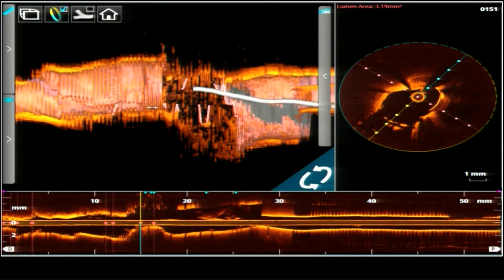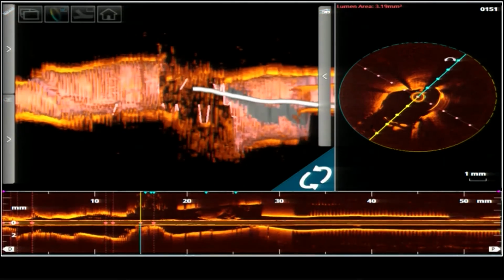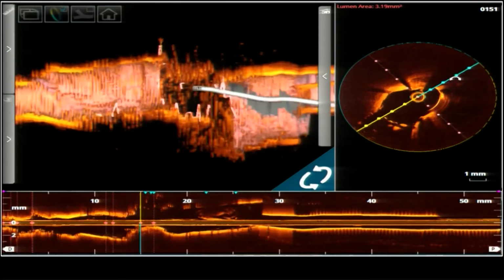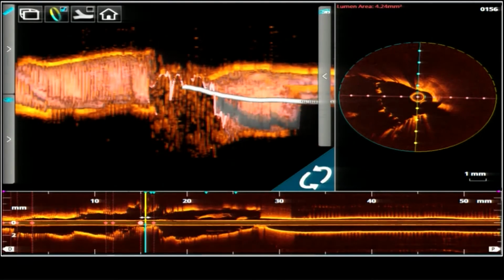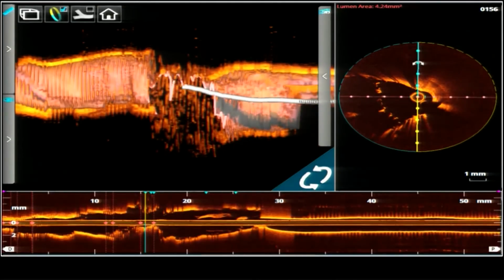The 3D navigation mode is not getting transmitted properly here. Unfortunately, there were a lot of artifacts, and the 3D navigation was not coming properly. Anyway, the struts appear to have been broken by the DK crush, the second kiss, I think. Yes, there are some struts across the circumflex.